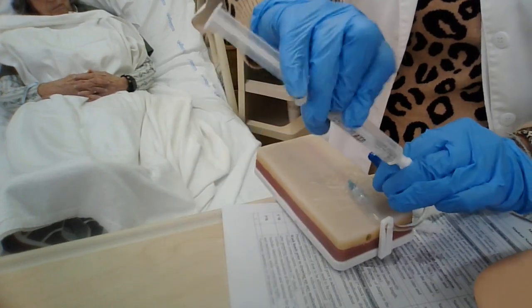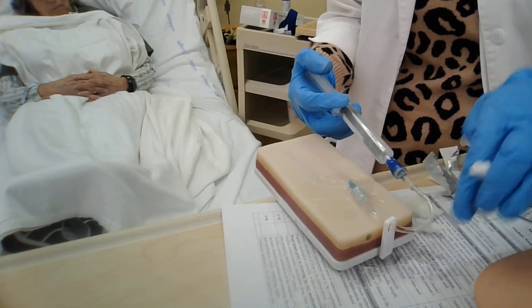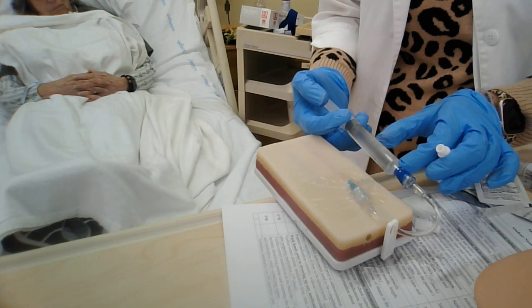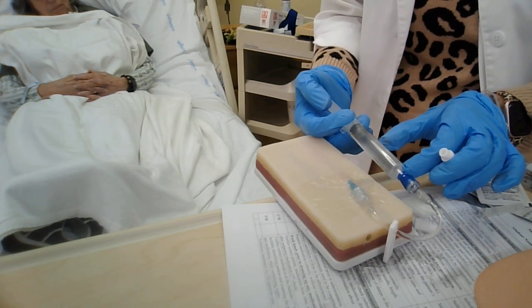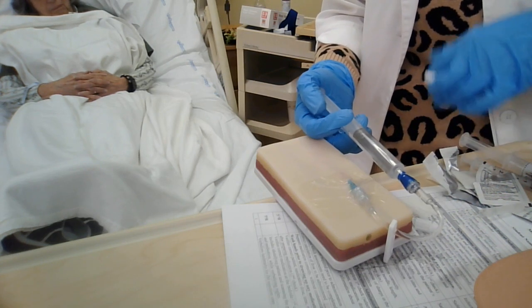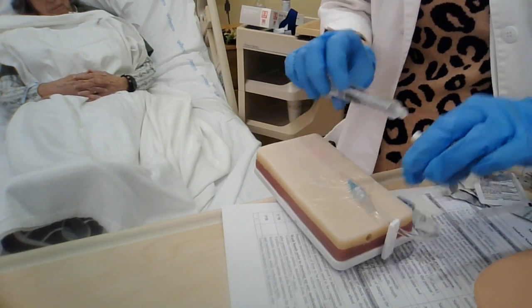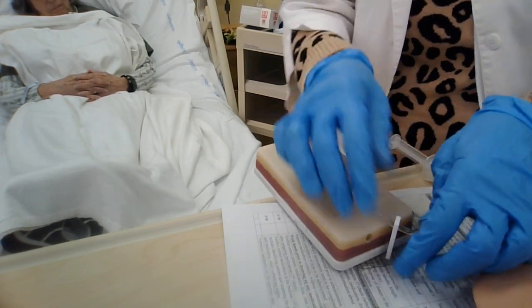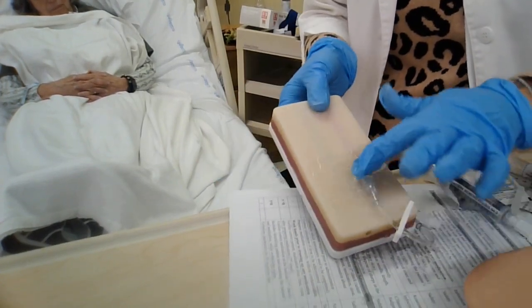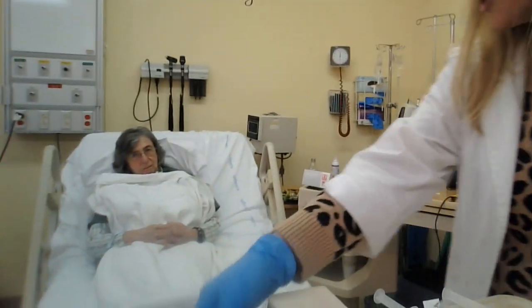We're going to take that last saline, and then we don't want to push this too quickly through because there's still medicine in there. So this time when you're flushing 3 to 5 milliliters to clear the line, do it slowly, over about a minute or however quickly that you are passing the medication to ensure that A, they got all the medication, but also you're not giving it too quickly. It's really important at the end of this one that you lock the IV, because if you don't, you might have blood back up into the system, or you might lose your line if this clots here. Okay? So I am all done with your medications.